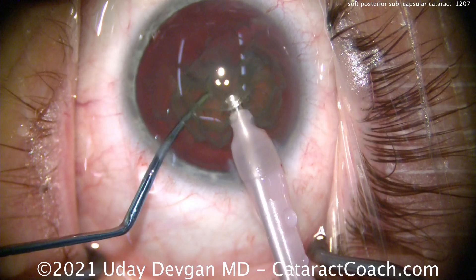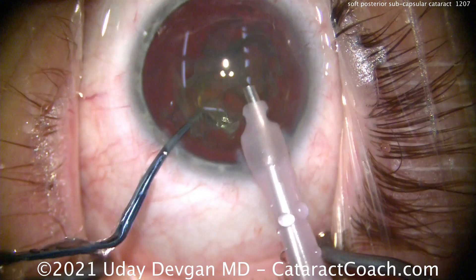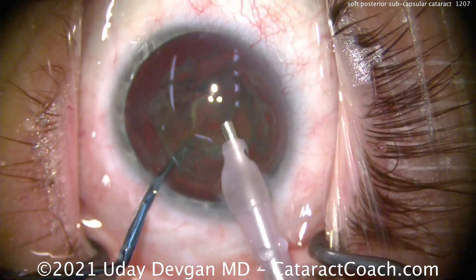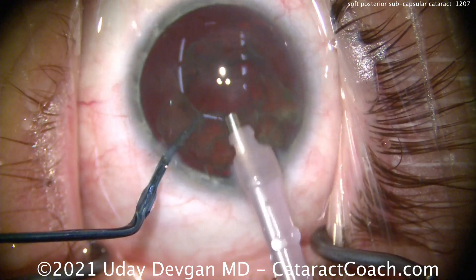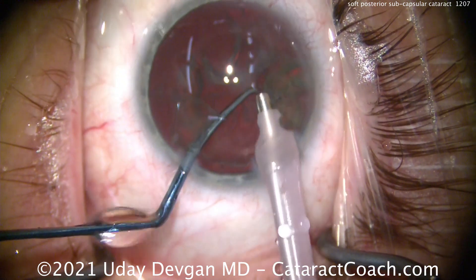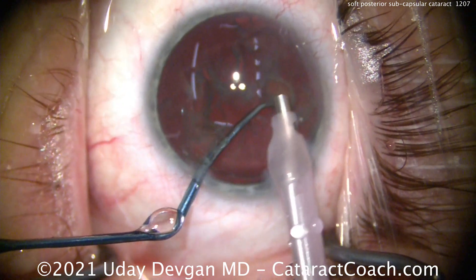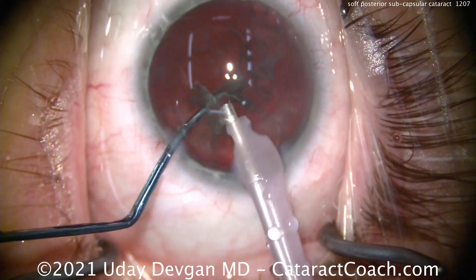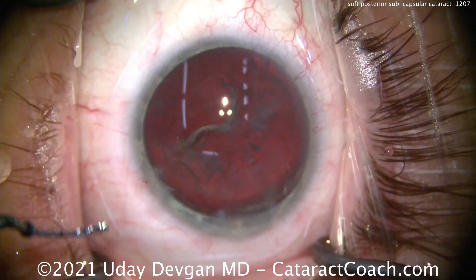Using the chopper to push the nucleus in front of the probe and simply aspirating it, because the lens is soft due to the patient's young age. Notice the chopper position — it's in the safe position to protect that posterior capsule. Slow down your aspiration flow rate: if you normally use 40 cc's per minute, try 30 cc's per minute — about one third slower — for a greater margin of safety. That looks pretty good with just a little bit of material left.